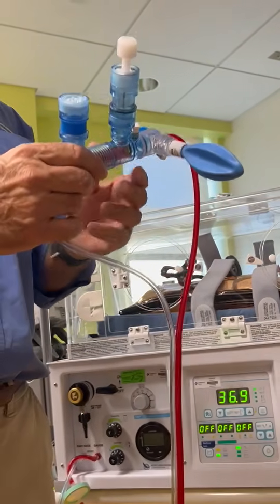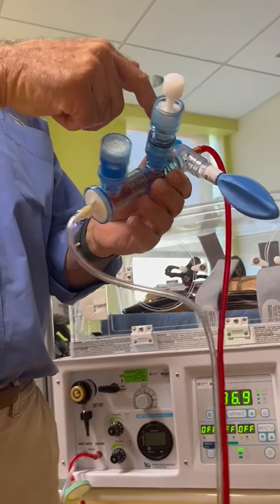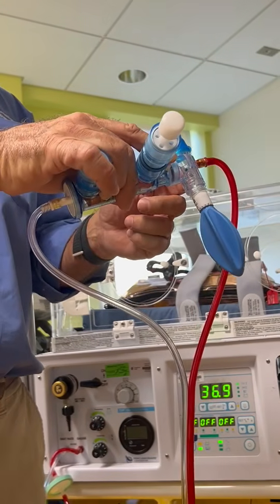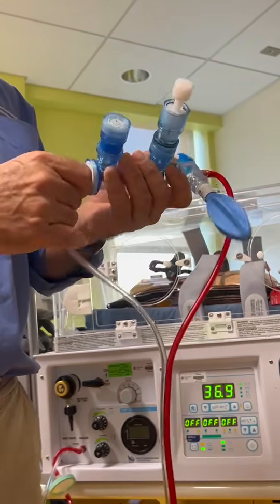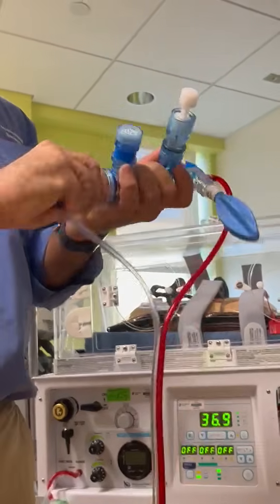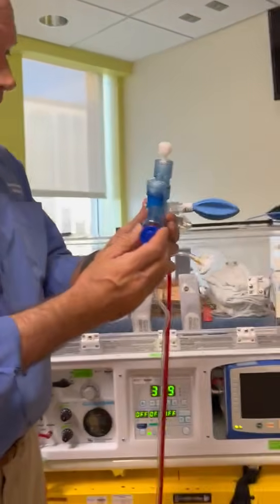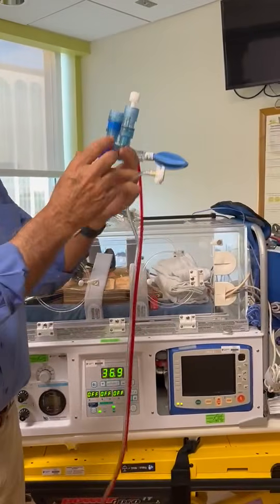This is just our monitoring port. And I'm assuming y'all tee in your nitric in this port, right? Yes. And then you measure in this port, right? Yes. Okay, all right, cool. Well, anyway, phasitron on my left hand. So what I'm going to do is take apart the inspiratory limb. And again, this is the phasitron on my left hand.